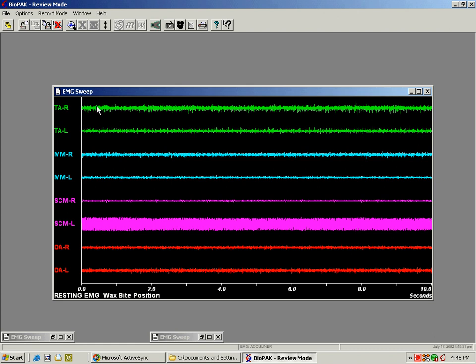We have the two green lines, temporalis anterior right and left, masseter right and left, sternocleidomastoid right and left, and digastric anterior right and left.